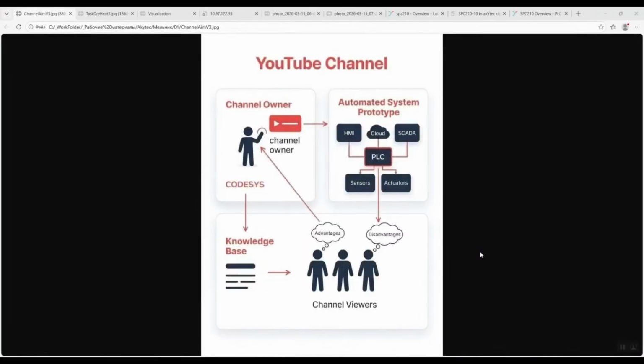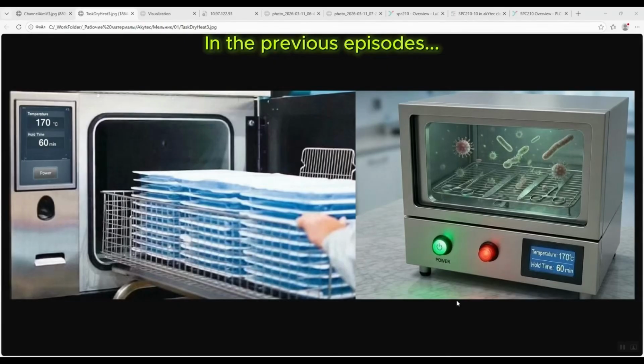The main goal of this channel is to teach you how to work with CODESYS using real-world examples of automated control systems, not with a virtual PLC, but with an actual controller and other industrial equipment from akYtec. Let's develop an automated control system for an industrial dry heat sterilizer, which is used to disinfect metal instruments, for example, in the medical or beauty industries.